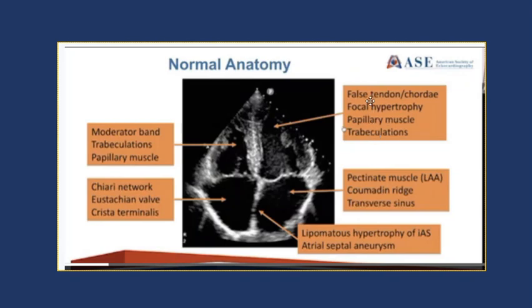What is a false tendon? What I tell the fellows is it looks like a cord that's going nowhere. What you see is like a string with the consistency of a violin string or guitar string going from the septum to the lateral wall. It does not connect to any structures such as the mitral valve apparatus or papillary muscle — it just extends from one wall to another. That is a normal structure and can only be seen in the left ventricle.